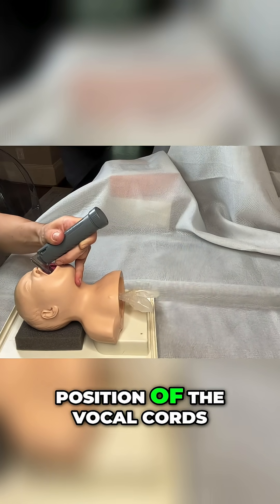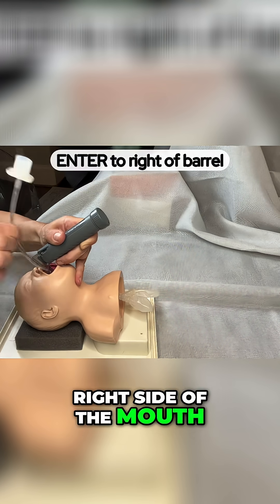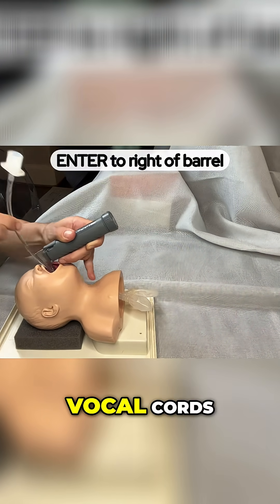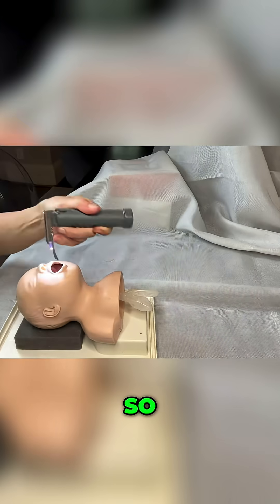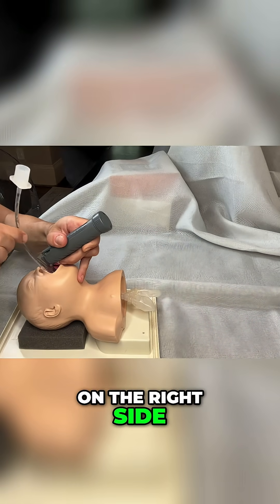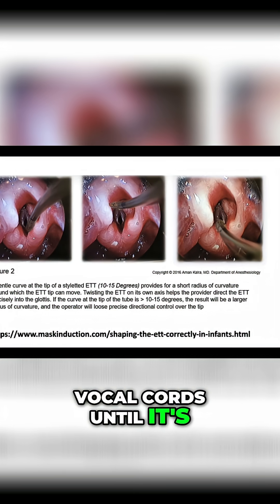Now I have a perfect position of the vocal cords. I put the tube in on the right side of the mouth — I don't want to do it down the middle of the barrel because then I'll lose my view of the vocal cords. We don't want to go like this, we want to go like that. So I put the ET tube down on the right side and thread it through the vocal cords until it's far enough down.